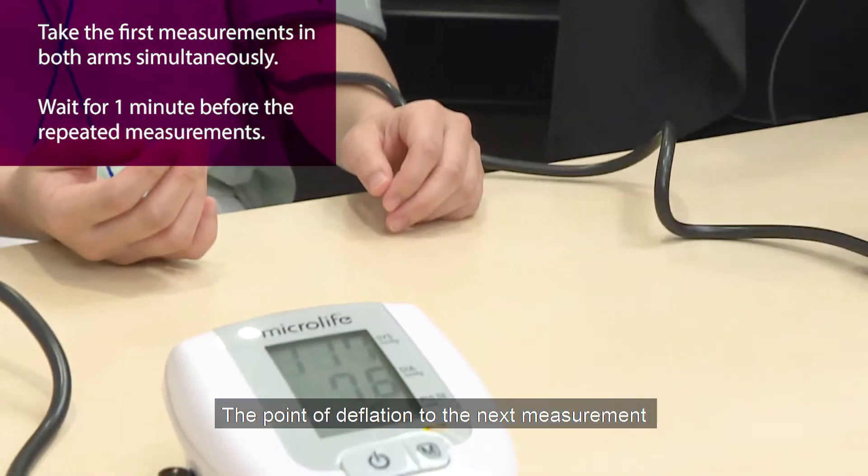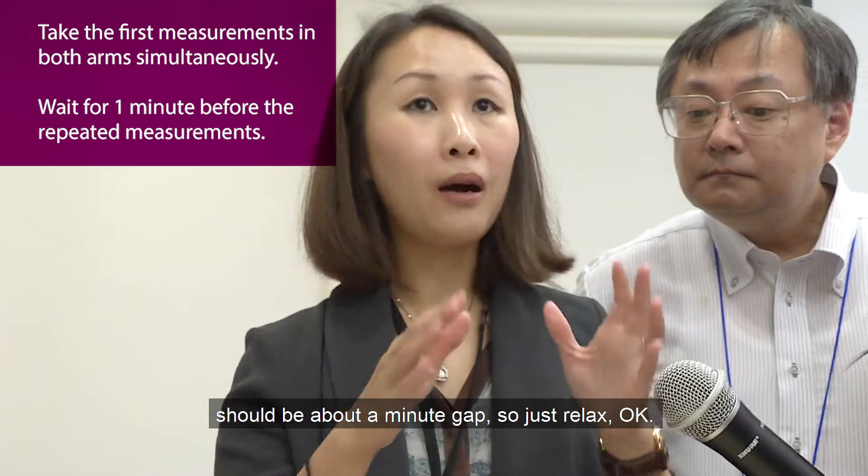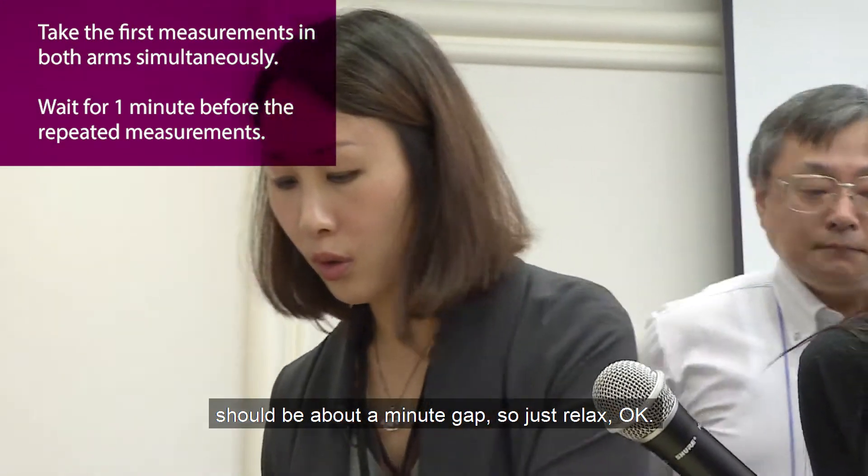The point of deflation to the next measurement should be about a one-minute gap. So just relax.